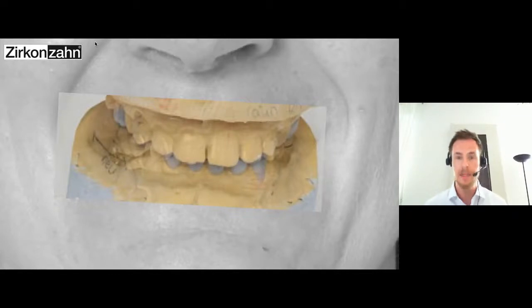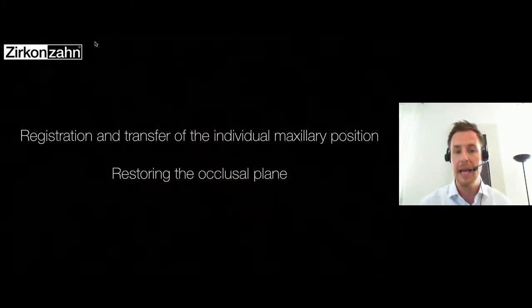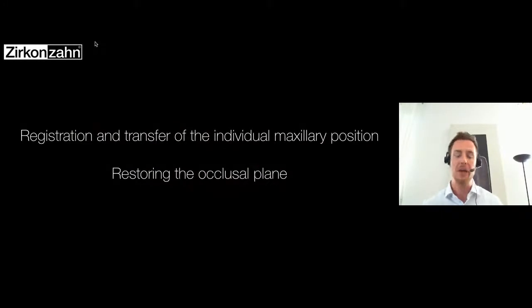What happened? Because of this kind of mistake and rotation, the rebuilt tooth seems longer than the other incisor because of the rotated axis. So the doctor has to adjust the length again. And that's why we thought we have to do something else.